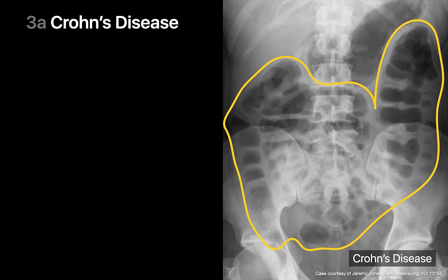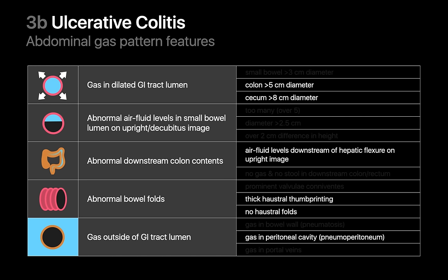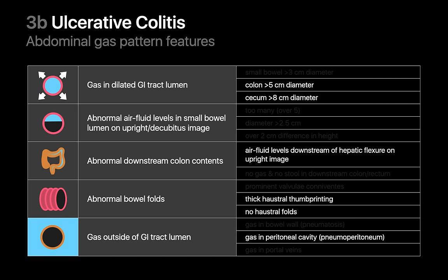X-ray findings of ulcerative colitis are mostly confined to the colon and include gas-filled or abnormal air-fluid levels in dilated colon. Loss of colonic haustration or abnormally thickened haustral folds and thumb printing can both present. Colonic perforation is a potential complication in severe cases, which can result in free gas in the peritoneal cavity. In this case of ulcerative colitis, pronounced haustral fold thickening and thumb printing are present in the colon while the small bowel gas pattern appears normal.